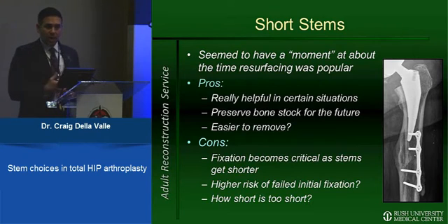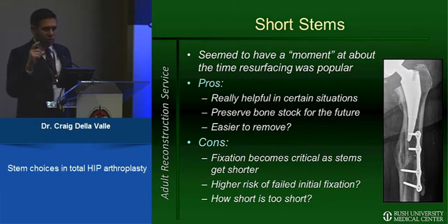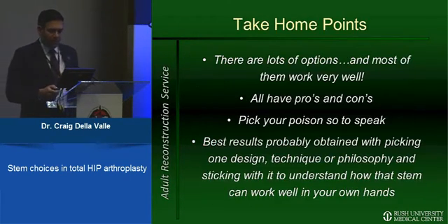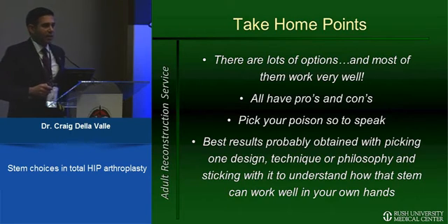They do potentially preserve bone stock for the future. Not 100% sure how much easier they are to remove, but they should be. But there certainly are some cons. Again, I think that these do have a real risk of periprosthetic fracture. And the fixation becomes really critical with a shorter stem. So I don't think we know how short is too short, but certainly something like this can be very technique dependent.